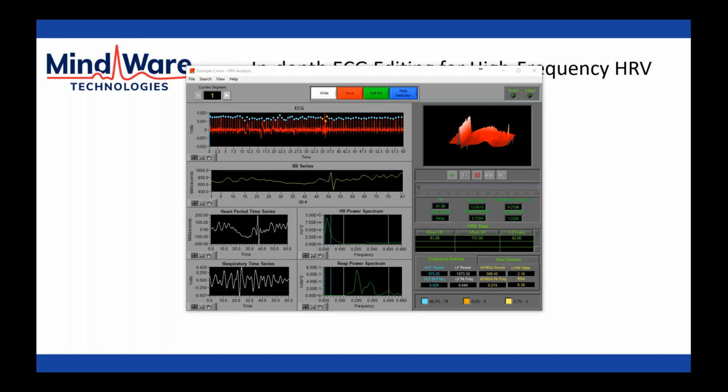So for ECG, you could move it a bit farther over on the clavicle and still have the same vector on the heart. So we're still going to have that pronounced positive R peak that we're using to identify the beat timing in this situation, and that's going to be enough.